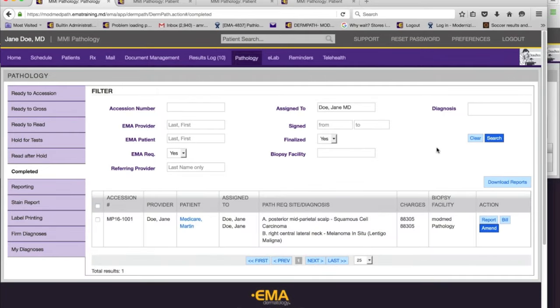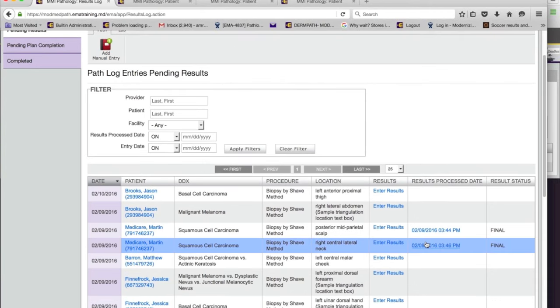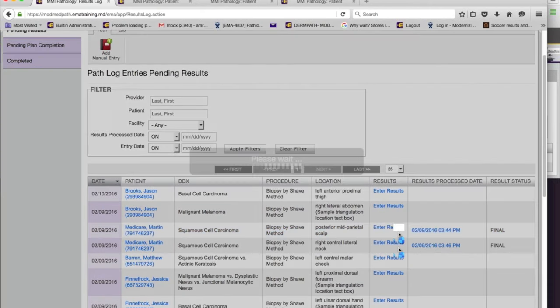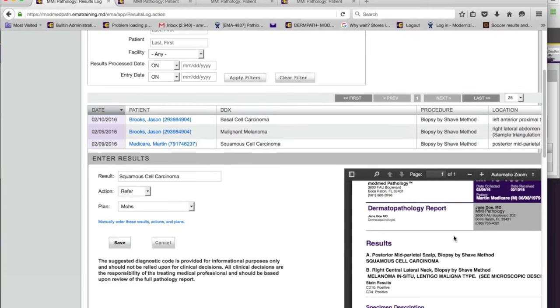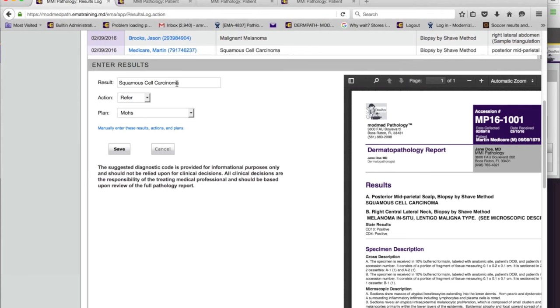Finalized cases don't disappear — you can filter for them and amend them. Now we go back to the results log and here they are, already entered. If I click on 'enter results,' the report is right here. If there was a second opinion report, it would show up here too. EMA loads the results for you and recommends an action and a plan. You can always overwrite, but all of this is done automatically based on setup. The MA or dermatologist can then move on with communicating results to the patient.